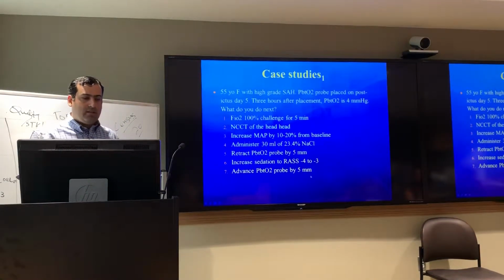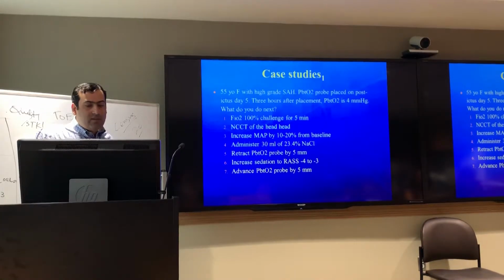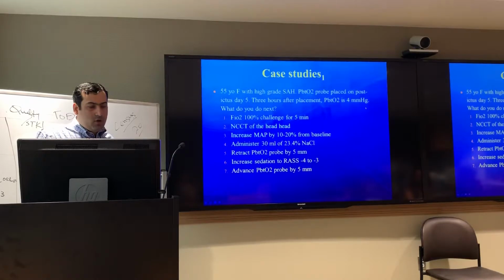So let's look at 3 cases. You have a 55-year-old woman, subarachnoid high grade. PbO2 is placed on post-bleed day 5. 3 hours after placement, the number is 4. What do you do next? Anyone? Exactly. You do a FiO2 challenge for 5 minutes. You just placed it and you don't know if it's working or not.